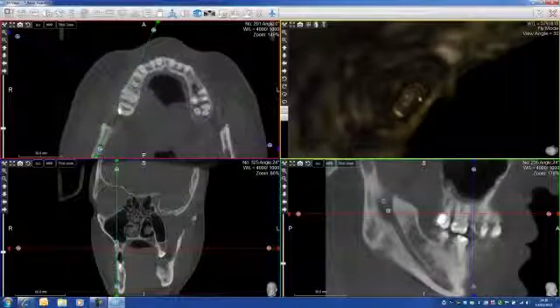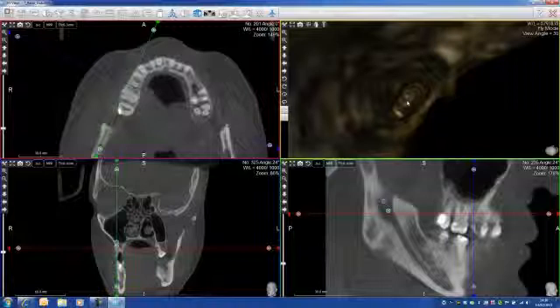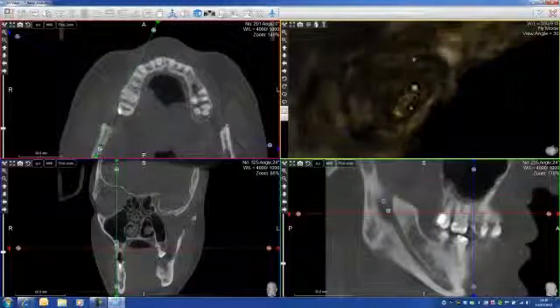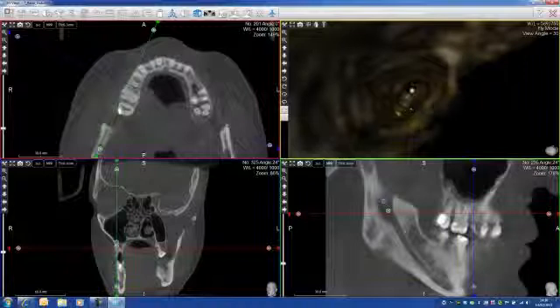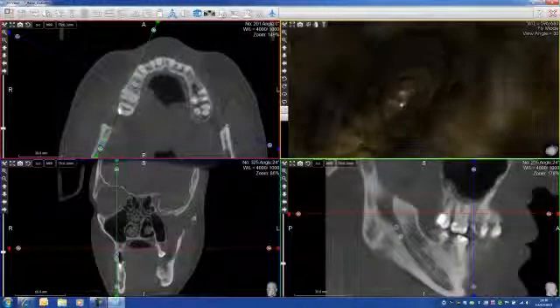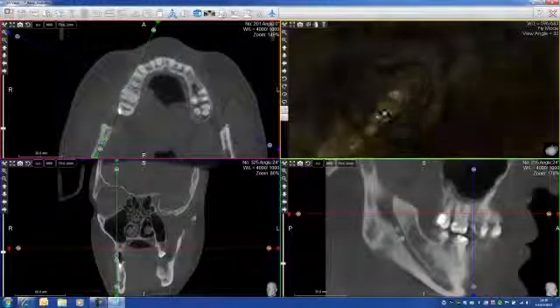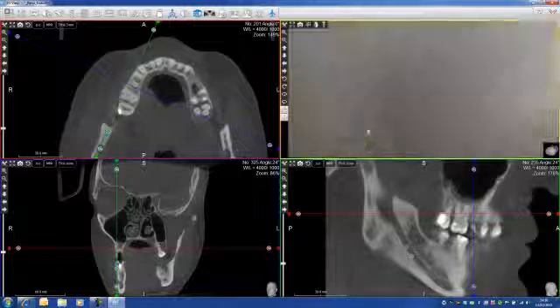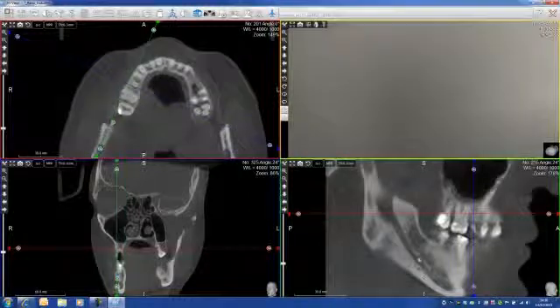Perfect. Look what we see here — we see the mandibular canal. I can increase the density to see it a little bit better. And now I can just go inside and navigate through.